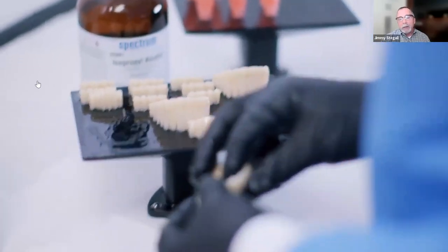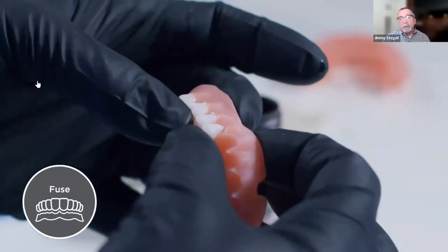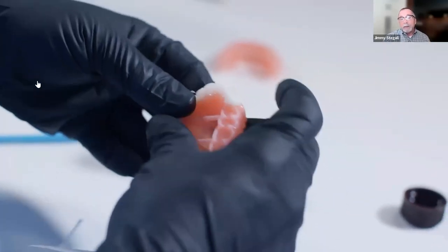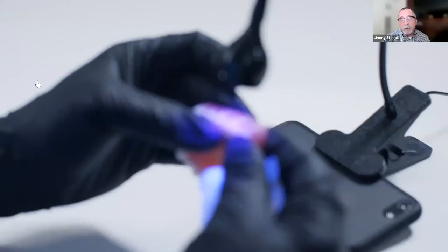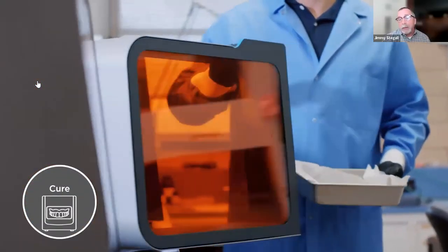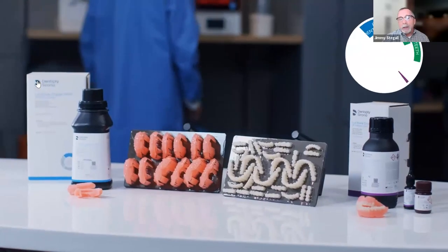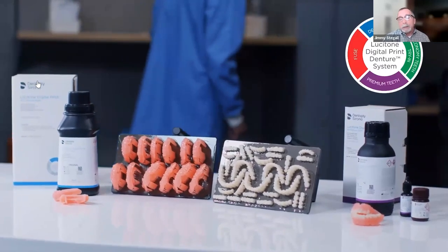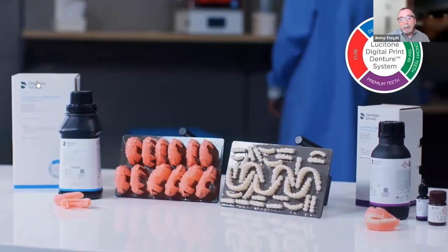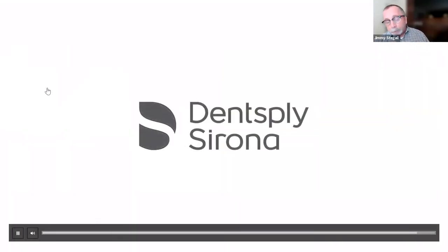We have all the shades — multiple shades of base plus all 16 shades of teeth — so there is not a denture case you cannot do with our system. Printing is the way it's going, guys. It's taking over not only our industry but manufacturing broadly. We need to change our mindset about how we've made things. We still expect quality, aesthetics, and strength — and thankfully these new systems deliver that — but the key benefit is scalability.